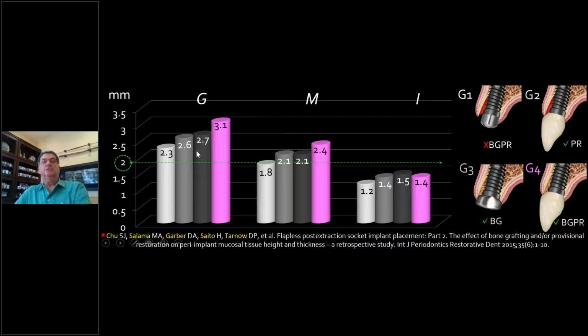Now, what is this green line here? This green line is 2 millimeters. And why do I have that line? Well, based on Bracco's work and a few others now, you want 2 millimeters of tissue on the front labial to your implant. Otherwise, you start to see the grayness of the metal through. I'm sure you've all seen that problem. So we want at least 2 millimeters of thickness of tissue to prevent the metal from showing through. So look at the extra thickness we got, and that's without a connective tissue graft, and that's important. So we didn't have to do that. Remember, this is a case where the buccal plate was present. That's key. So that's our winner, and so that's what we do on a routine basis.